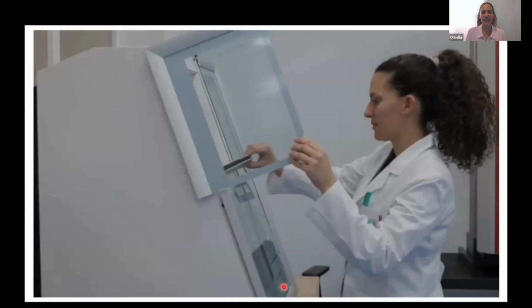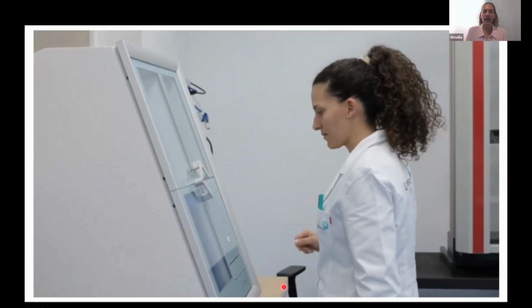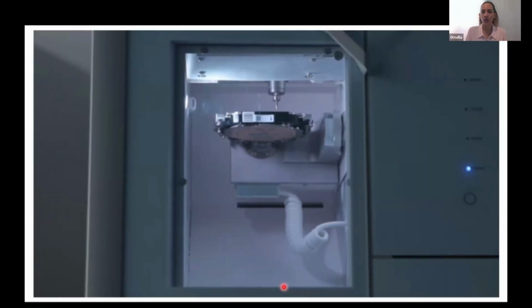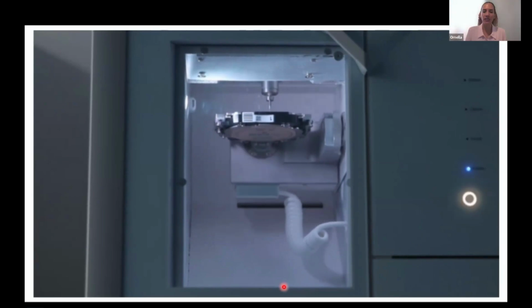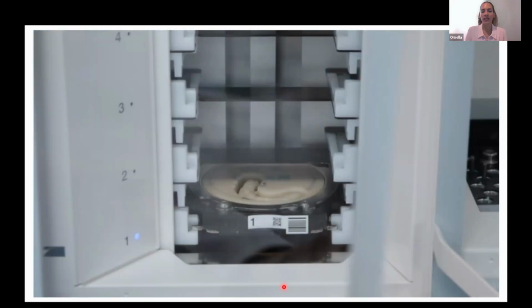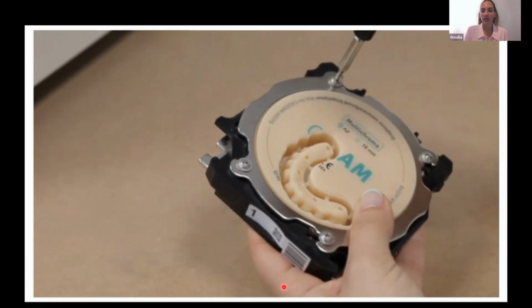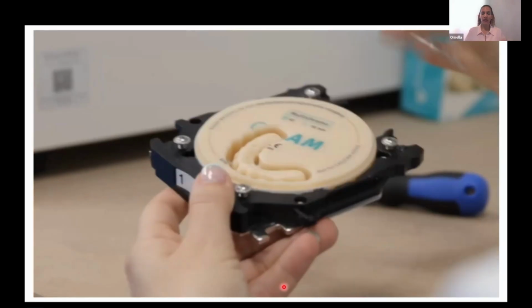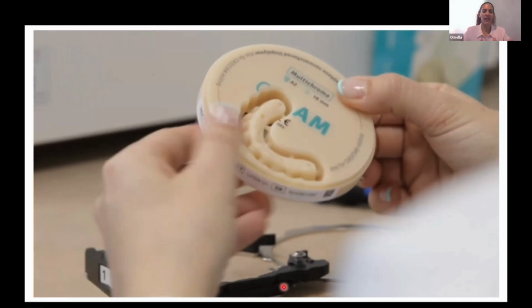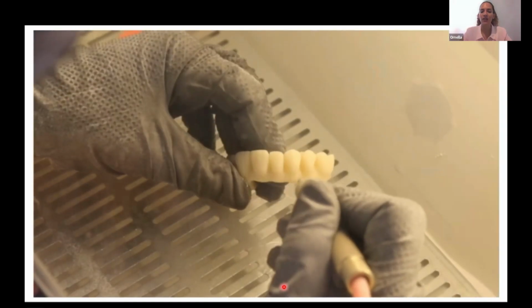Once we have designed our G-CAM restoration, we are going to mill it. As you can see here, we are milling in a dry process, not wet, but you can do it in both. The strategy that we choose is the PMMA strategy with the same tools that the milling machine uses for it. Remember that we don't need any thermal process. We take out the disc from the anchorage and then start cutting and doing the finishing. I don't need any thermal process.